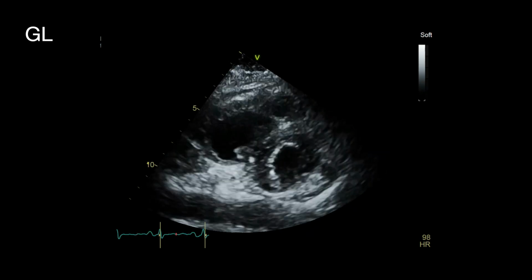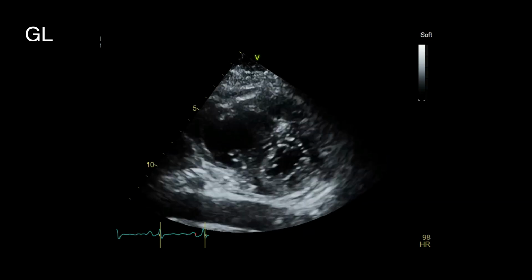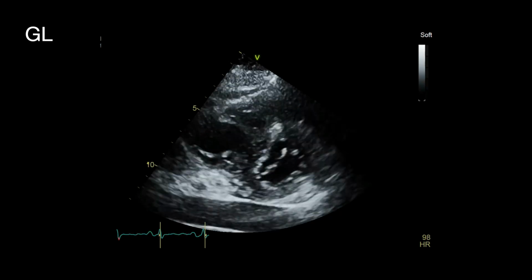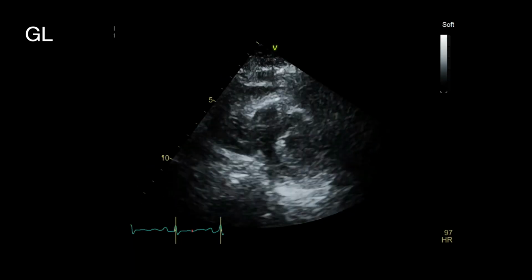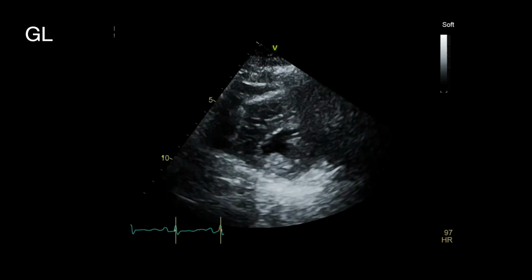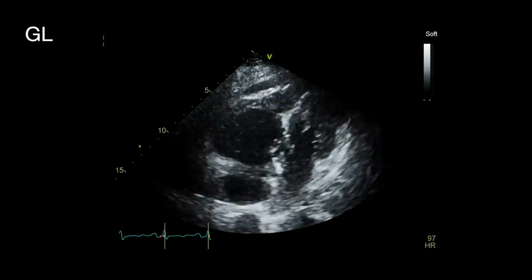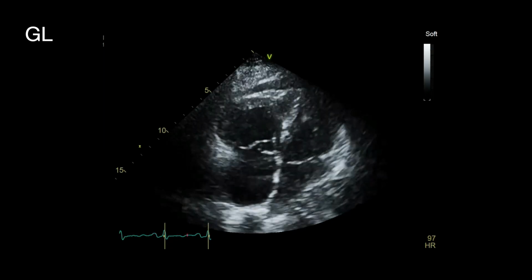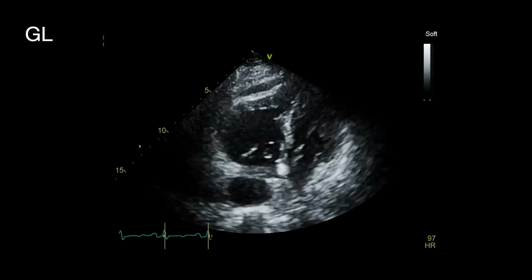So parasternal short axis view, and what we can see is a small LV with abnormal septal motion, so that's septal flattening, and the impression already of a very dilated RV. Move down to the mid-papillary level, which is showing similar findings. Apical 4-chamber view, which is a more RV focused view. And again, the RV looks severely dilated.